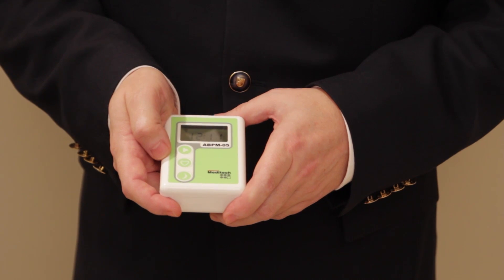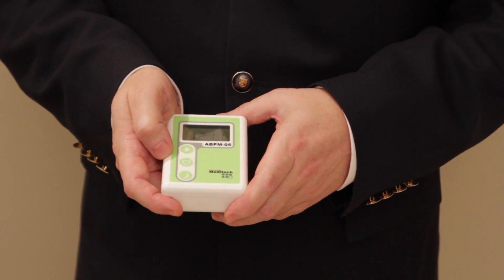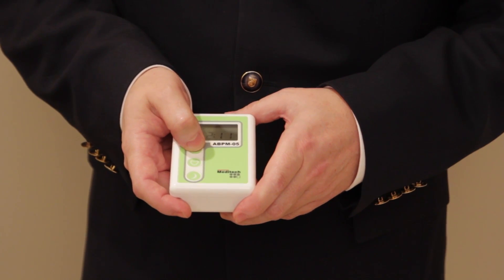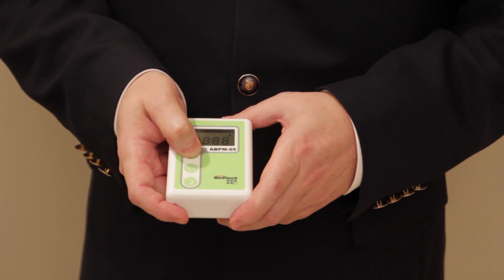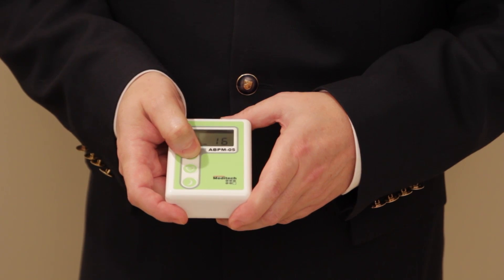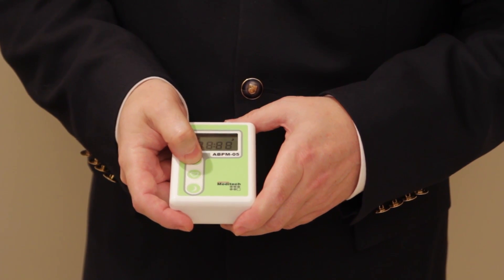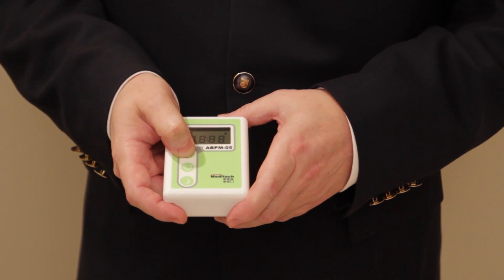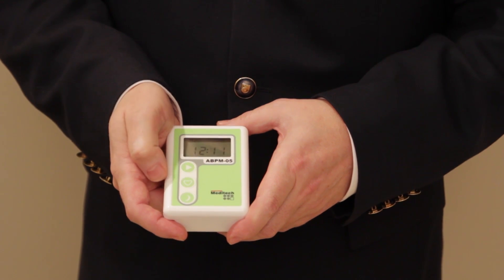Once batteries are inserted, you may not have enough time to check battery voltage on the display. You can check battery voltage anytime by pressing and holding the start button for at least 5 seconds. The LCD will show all segments and then display the battery voltage.